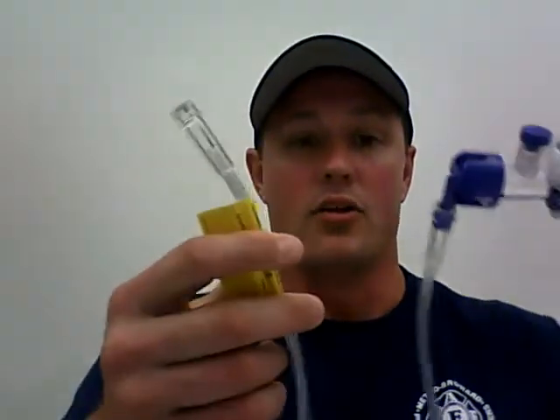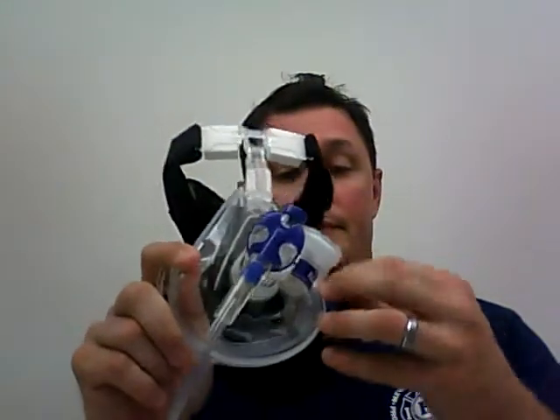You have your airline hose here, which will connect and give them oxygen. I'm not going to go over it, but there are different settings that you can use, and there's a little cheat sheet on here to help create the right airflow for your patient. When you're applying the CPAP, you've got these nice little clips here on the side. You can unclip those, or you can just stretch it around the person's head and put it on. I'll just show you how to put it on real quick, and that'll end the video.